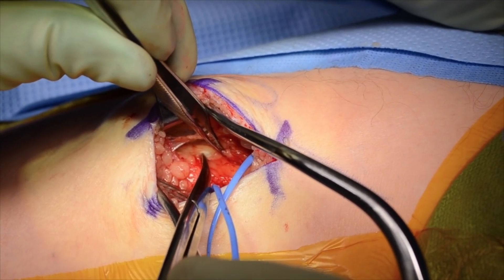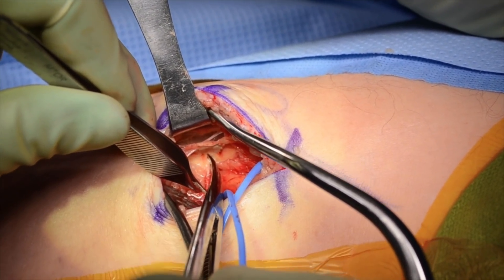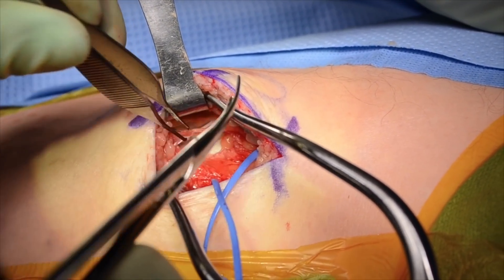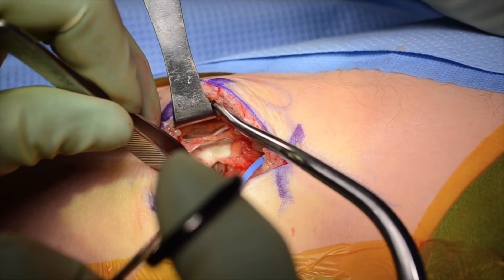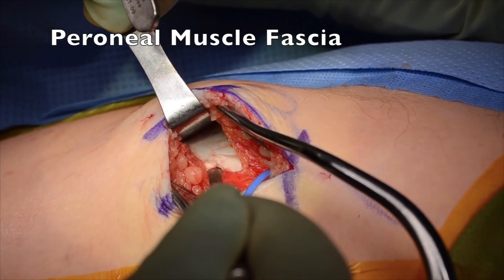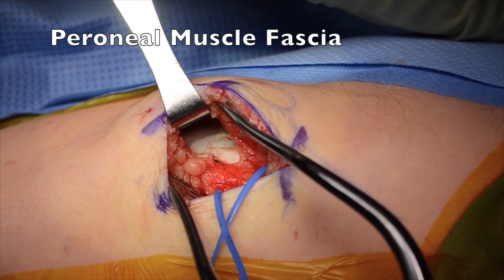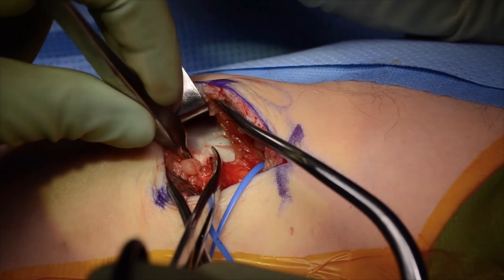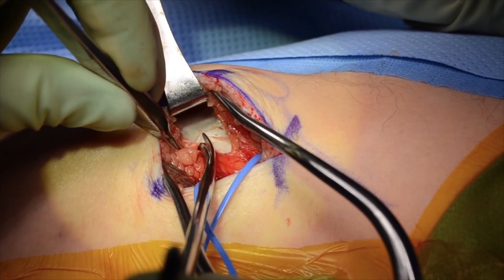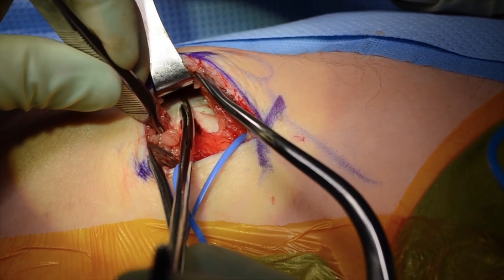Attention is then turned to the distal portion of the nerve. One of the primary sources of entrapment is the fascia investing and beneath the peroneus longus. This fascia is first dissected away from the underlying muscle and nerve, and then sharply divided, taking care to cut only the fascia and leaving most muscle fibers intact.